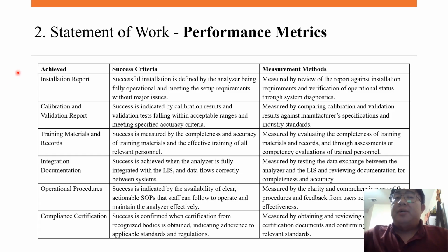Also about the performance metrics based on the task: installation report, calibration, validation report, training, integration, operation, and compliance certifications. They do have their own success criteria and measurement methods. It will be best to look at each individual one and become familiar with it. It's part of the system engineer's role to create better performance that will affect the overall life cycle process.